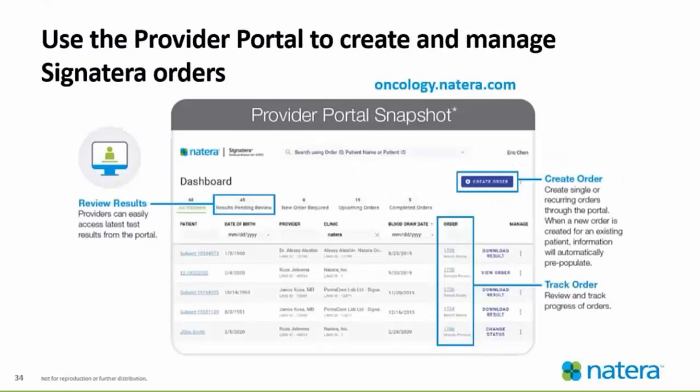Here's a sample of what the portal looks like. The provider portal can create and manage Signatera orders — you can review results on the left and easily access the latest results. On the right side, you can create an order — single or recurring orders. When a new order is created, it will automatically pre-populate. You can also track the order and see where in the process it is, so if you're eager to have that result or a patient is coming back that following week, you can see the progress of the order you submitted.